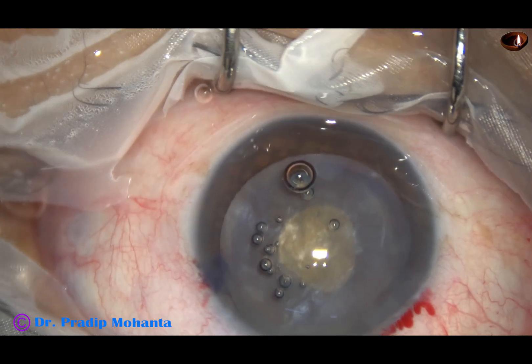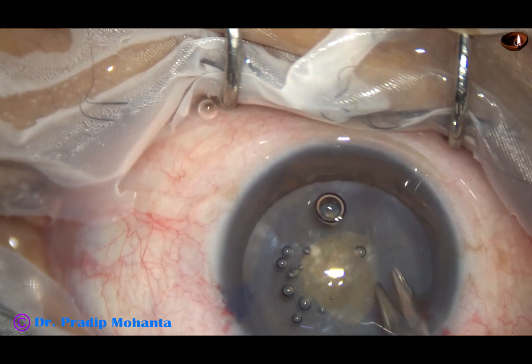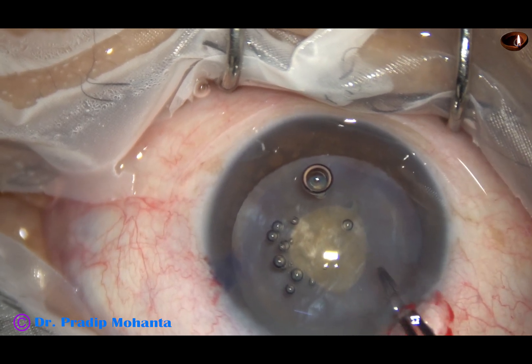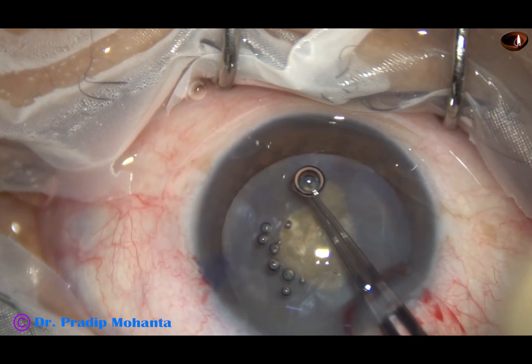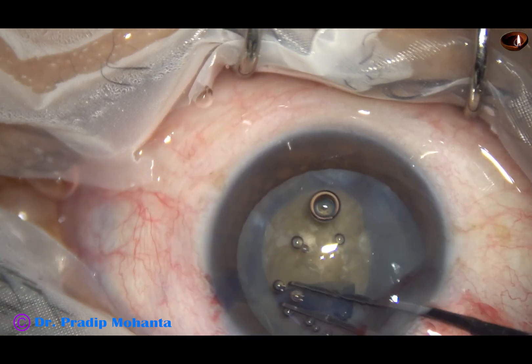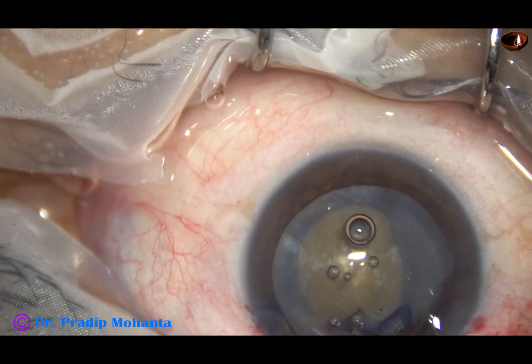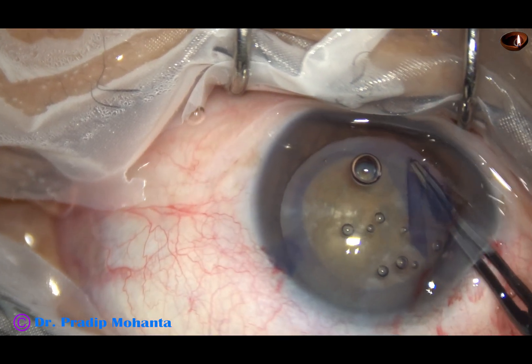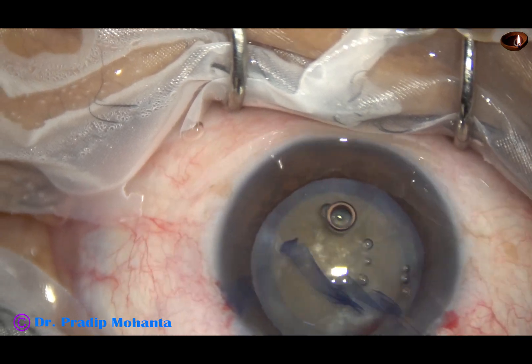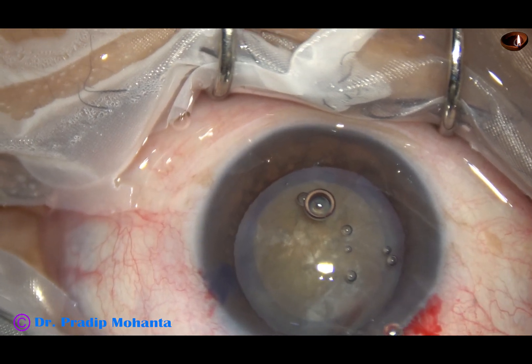Now visco is again used to fill up the anterior chamber. This is a small nick at the margin of the mini rexis. We take the instrument again and enlarge this small rexis, completing an optimum-sized rexis of about 5 mm or 5.25 mm.